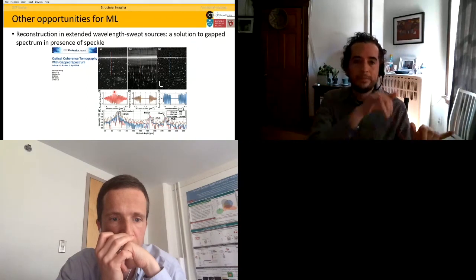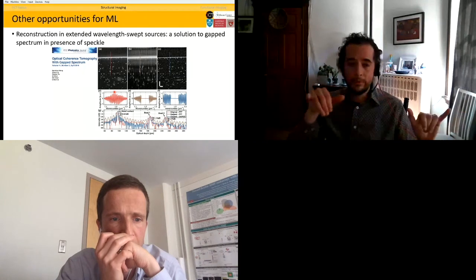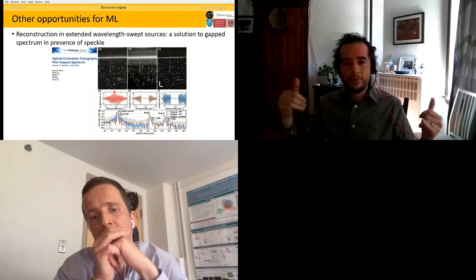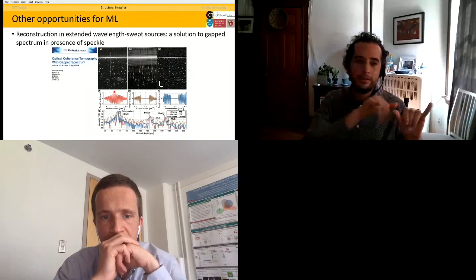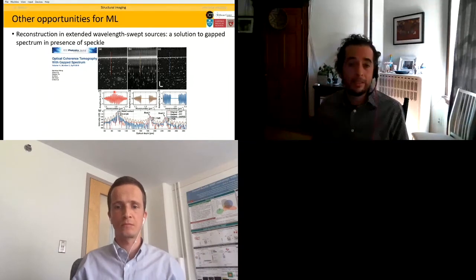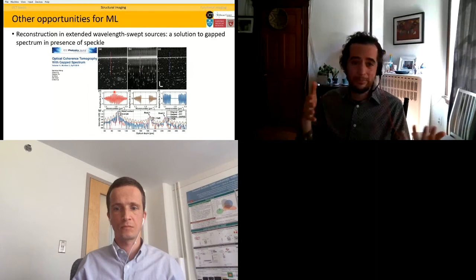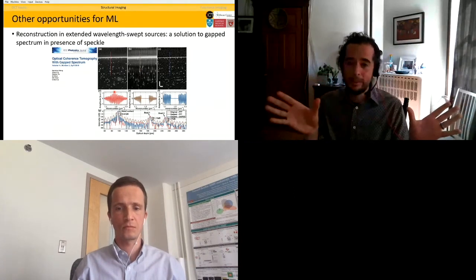So there are some islands of appropriate wavelength ranges that we can use. We could envision, for example, using some of these ranges that are far apart and have a big gap in the data. This is similar to the MRI case of sparse sampling, but in this case it's not really sparse. It's about having blocks and then having big voids in between.